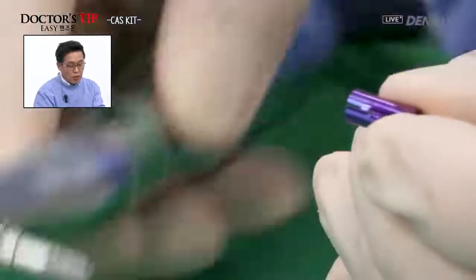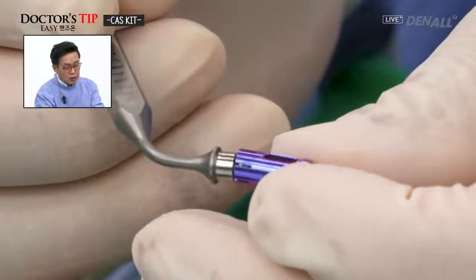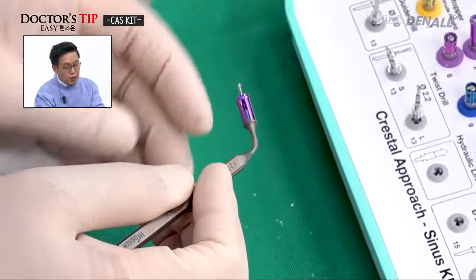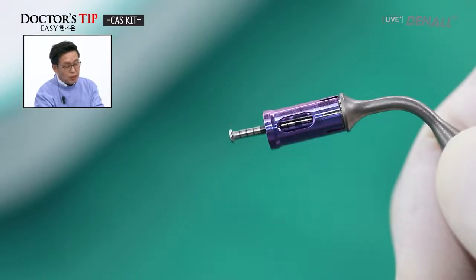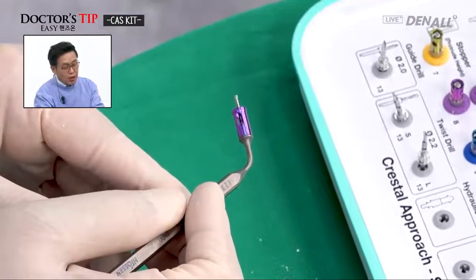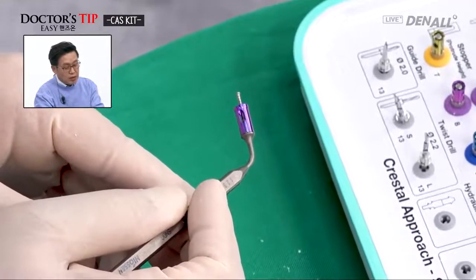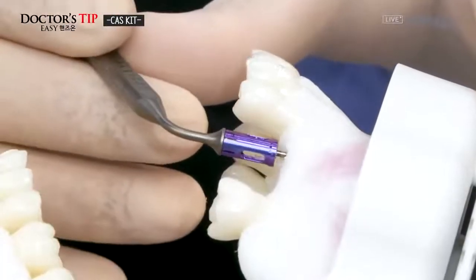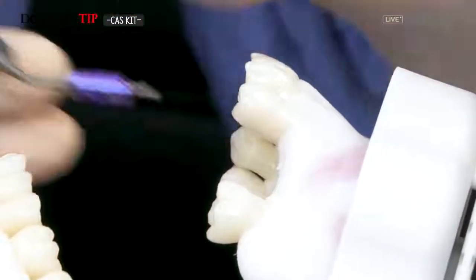So the depth gauge will be connected with the same stopper. In the depth gauge, the same 5 millimeter stopper is connected. The drill is 5 millimeters, but the depth gauge is a little bit longer, 5.6 millimeters, and this will be going into the drill hole to check whether the sinus floor is penetrated or not. As you can see, it is not penetrated yet.